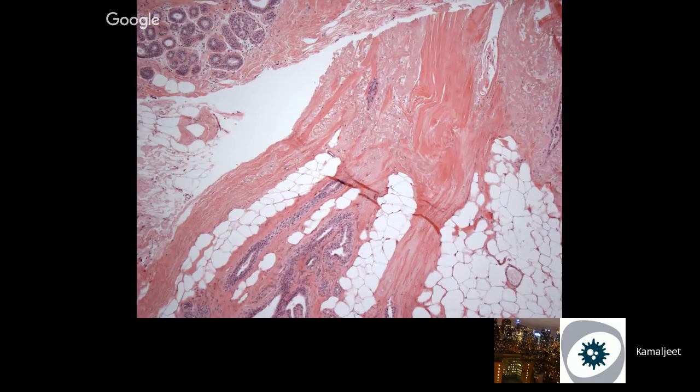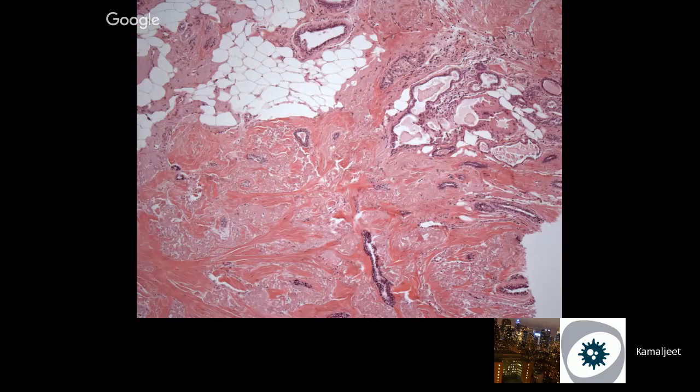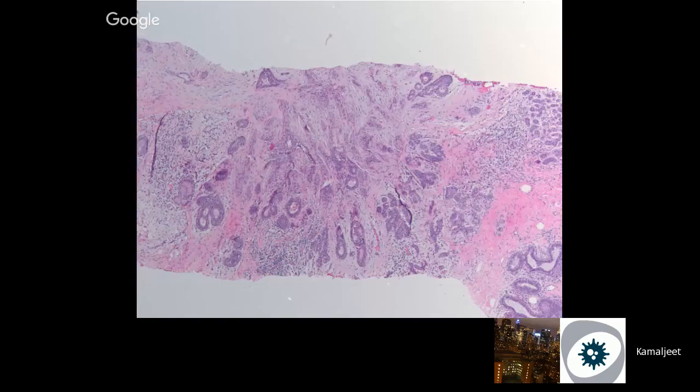Another example of radial scar. Another thing is there's something called an incidental radial scar. That really is not a target lesion. So you can actually spare an excision if it's an incidental small radial scar. And obviously you need the radiology-pathology correlation.